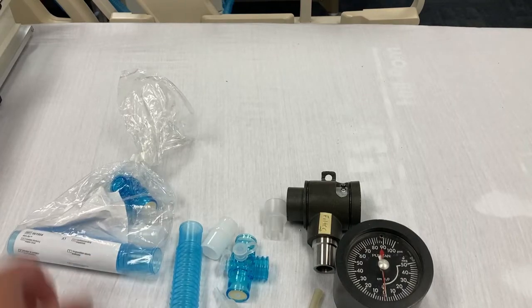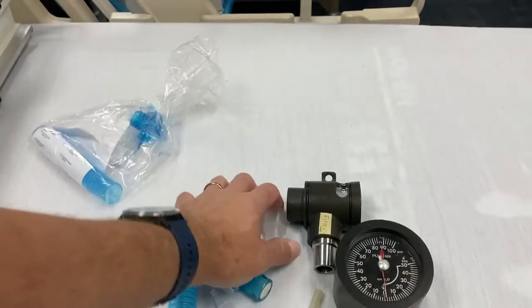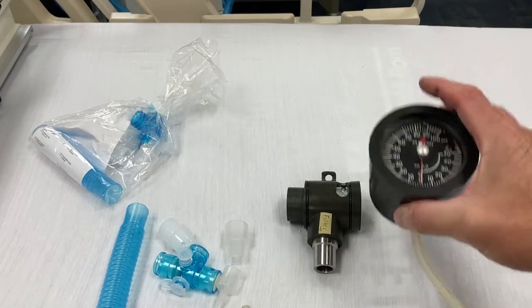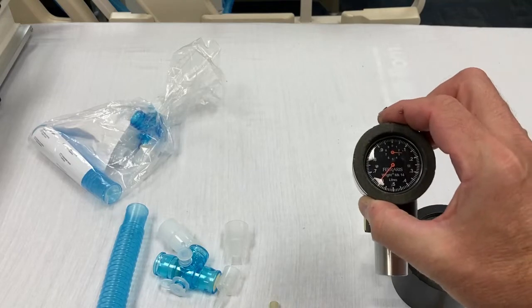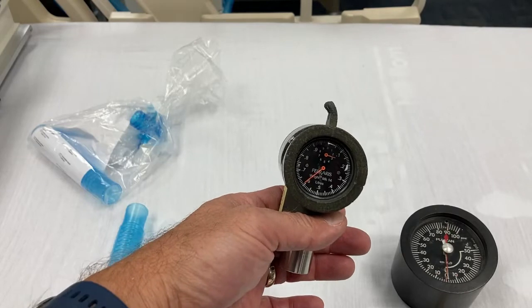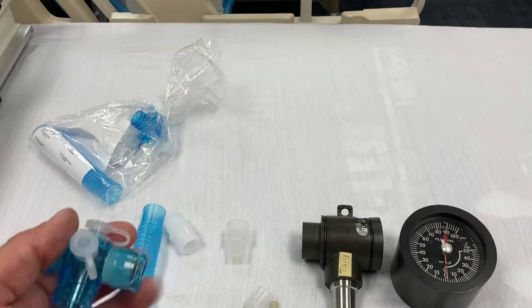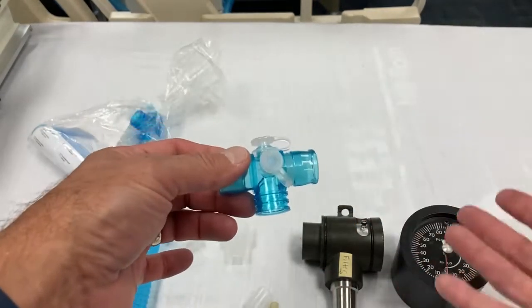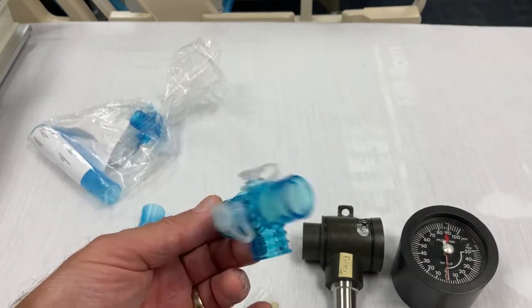All right, so we have our parameter kit, already comes pre-packaged, and I have all the pieces out here, and I'll go over those. We also have our NIF meter, which measures pressure, and then we have our Wright respirometer. This is a really old one, but that will measure minute volume. Okay, if we get our minute volume and respiratory rate first, this parameter kit has some ports and things, and you'll see some variance in how people use these. I'll show you how I do it.